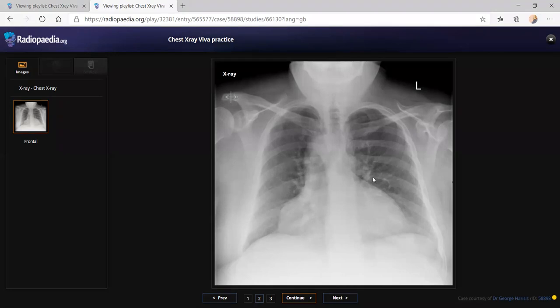If that is the aortic knuckle, which is the ascending aorta? Good, you are right. I understand what you're saying. Because this soft tissue shadow is merging with the right cardiac border, I think this could be a case of cardiac transplant where it leads to such an abnormal morphology. Will you get a cardiac transplant without any median sternotomy wires and surgical clips? No, we can't. Okay, so it's an asymptomatic patient coming for abdominal surgery.